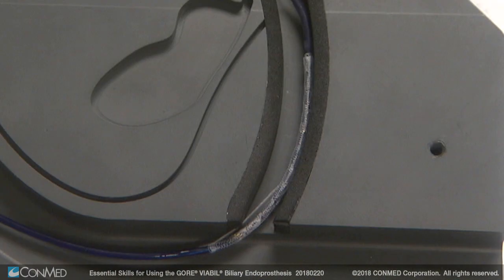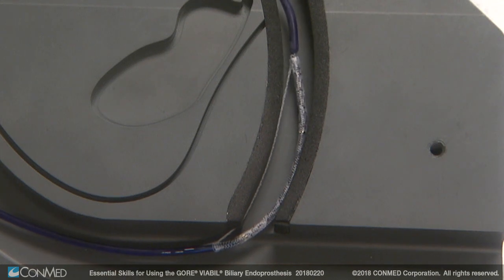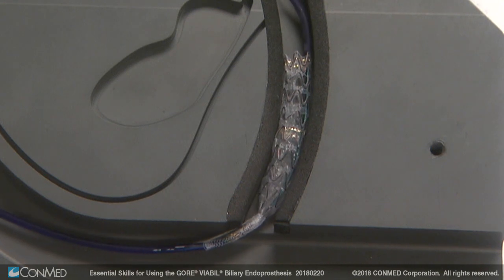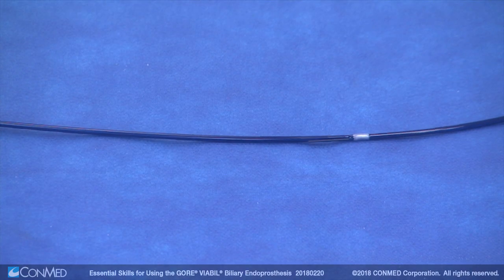The Gore Viable is encased in an EPTFE string. As the string is pulled, it runs up to the top of the stent, allowing it to crown, and then comes back down for full deployment.